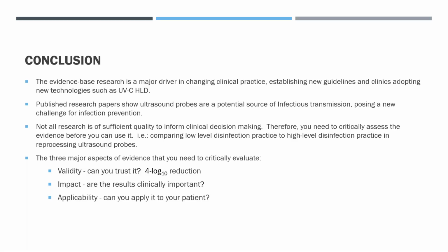So, 3 major aspects of evidence you need to critically evaluate. Validity: can you trust it? For low-level disinfection, only a 4-log reduction. Impact: are the results I've shown you in the research clinically important? I hope I've convinced you that use of low-level disinfection places your patients at risk for acquisition of an infectious agent that was present in a previously studied patient, and the contamination of the probe occurred and remained on the probe despite low-level disinfection. Not only potentially, but actually, that could lead to infection of the next patient. And applicability: can you apply this to your patients?